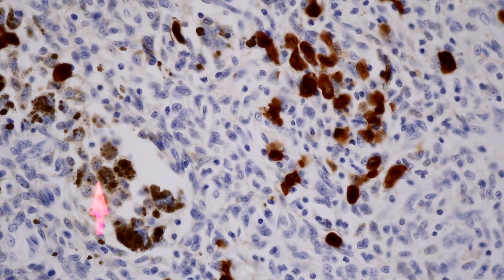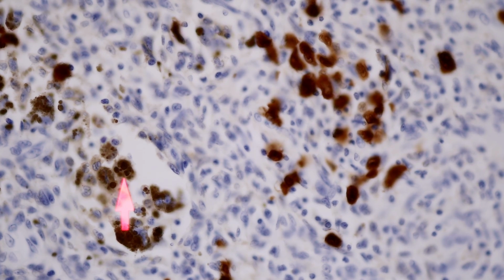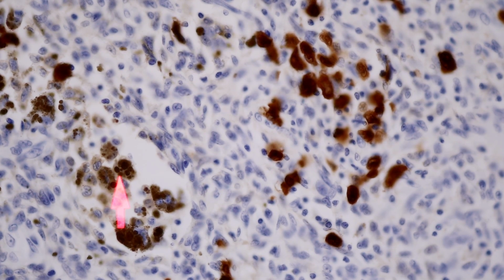Hemosiderin often does also have an orange or kind of golden color, but still usually looks different and also is more kind of globular and chunky and will also be refractile. And you can kind of see as I focus up and down here that you can see each individual blob of hemosiderin in these hemosiderin-laden macrophages. They're kind of standing out because they're all different sizes and shapes.